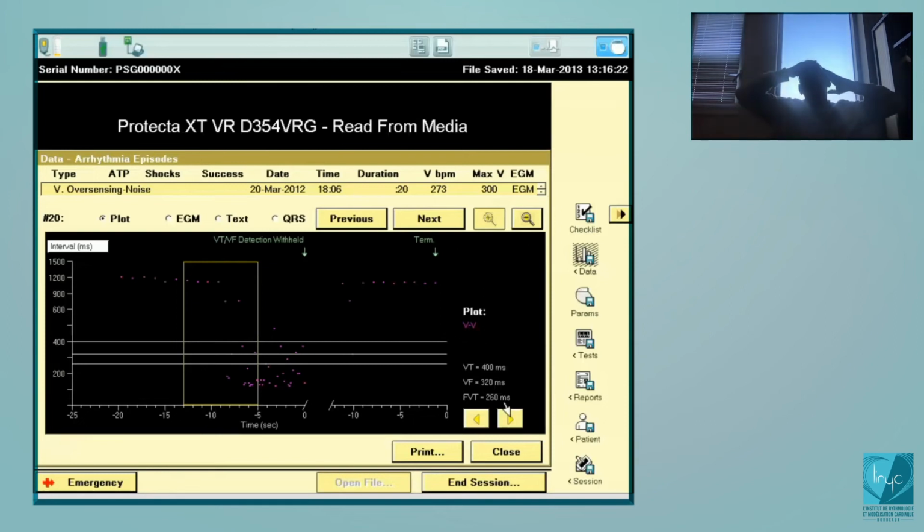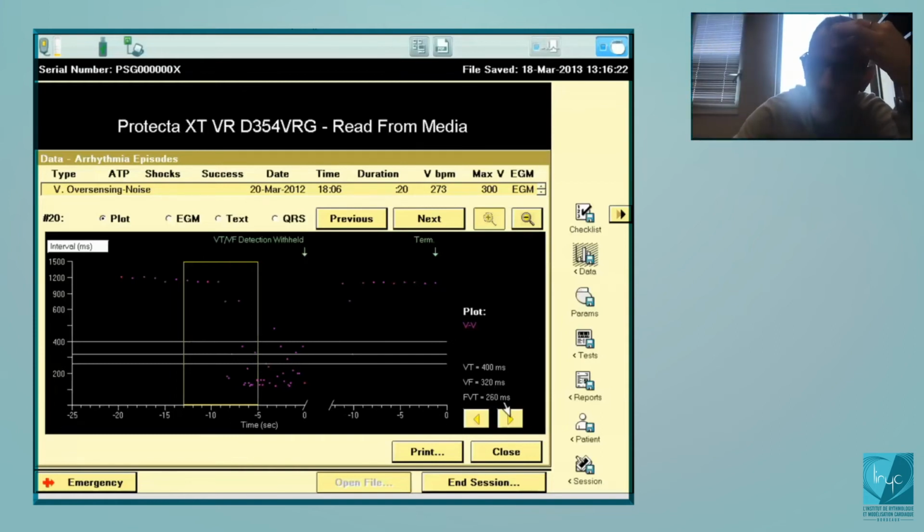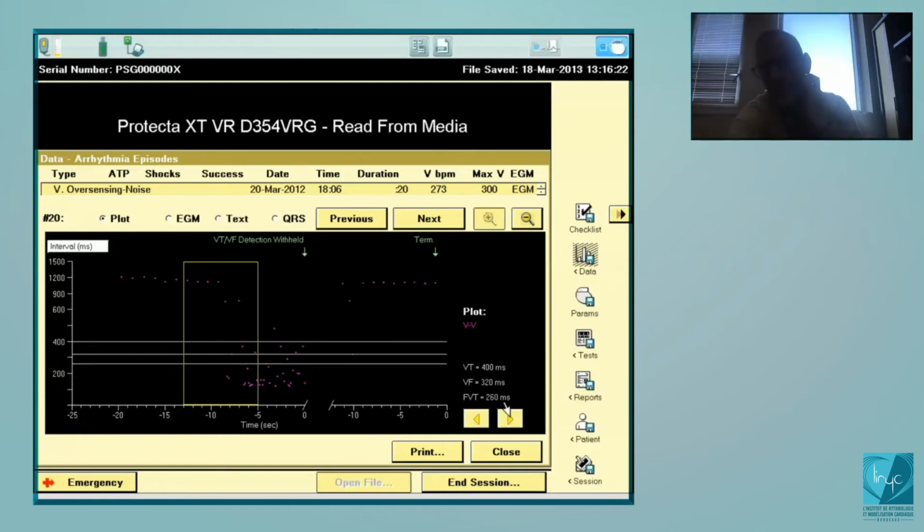So as I explained, there have been some problems with Medtronic leads, and the same for Abbott, and these two companies had to develop specific algorithms to avoid inappropriate therapy. The very first one is the LIA. How does it work? Yes, it's based on 3 parameters. Very simple. The LIA is a magical algorithm. It works very, very well. If the patient is followed with remote monitoring, with this algorithm you will decrease considerably the risk of inappropriate therapy.